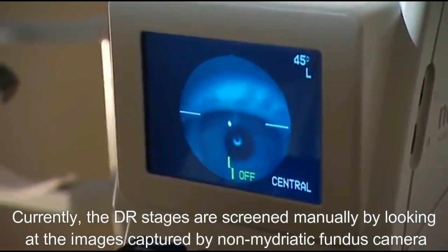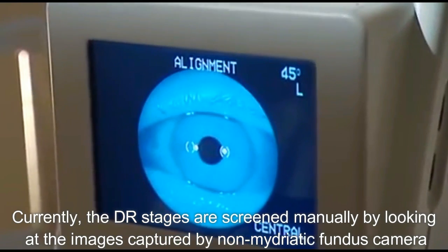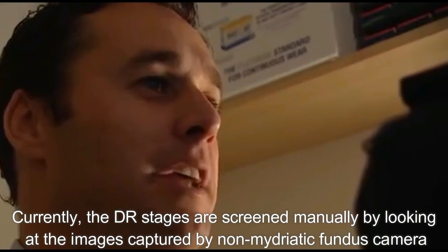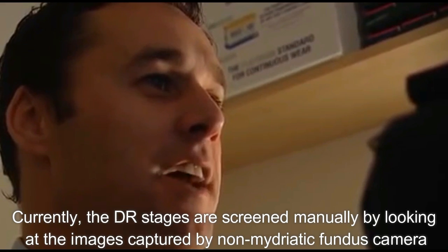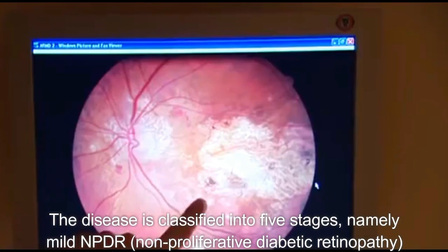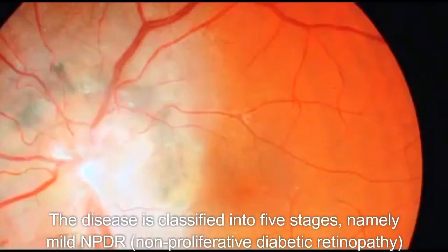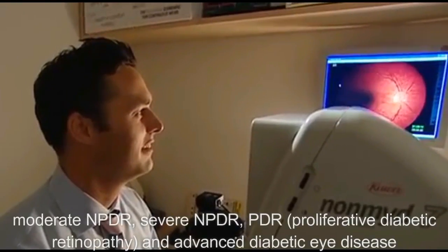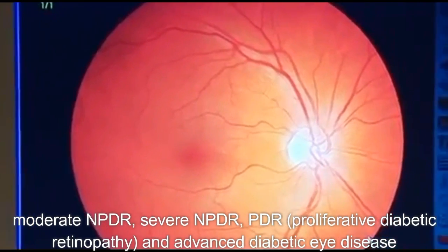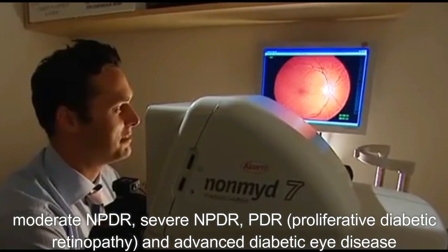Currently, the diabetic retinopathy stages are screened manually by looking at the images captured by a non-mydriatic fundus camera. The disease is classified into 5 stages, namely mild NPDR, moderate NPDR, severe NPDR, PDR, and advanced diabetic eye disease.